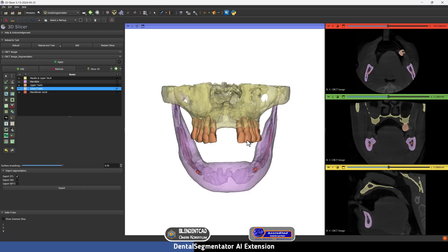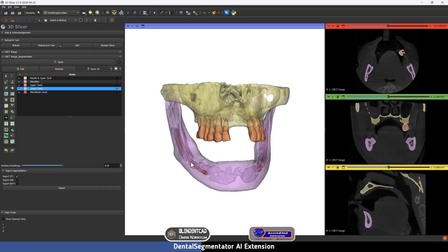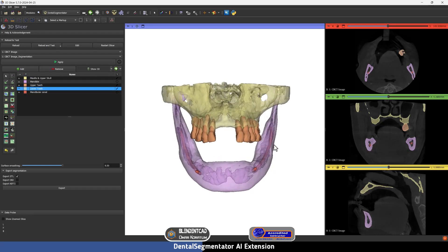As you can see, Dental Segmentator has finished segmentation. It has segmented the maxilla and mandible separately, and the teeth. Unfortunately there are no lower teeth here, but it has also segmented the inferior alveolar nerve. Now we want to know the location of this radiograph and its segmentation in relation to the Blender for Dental center origin.